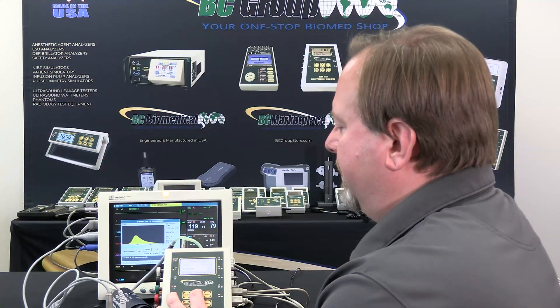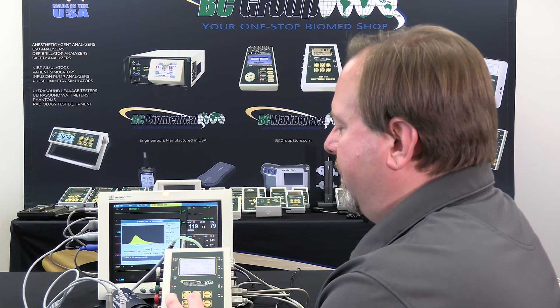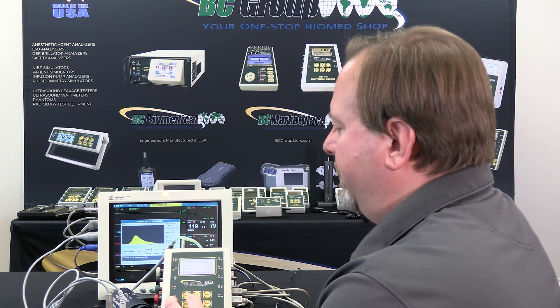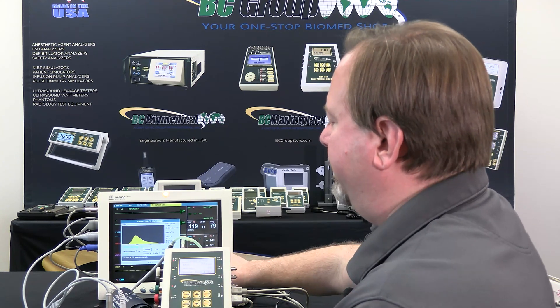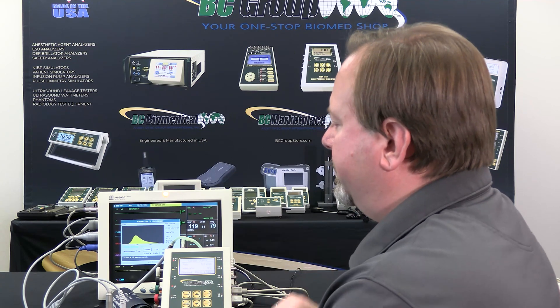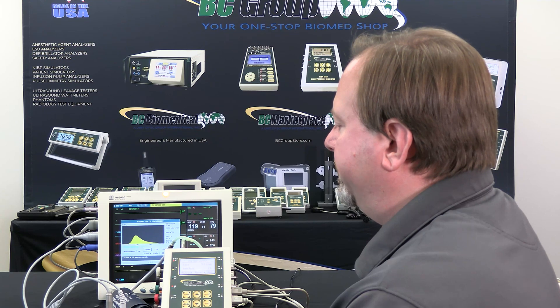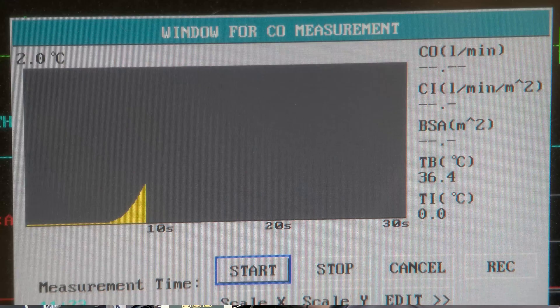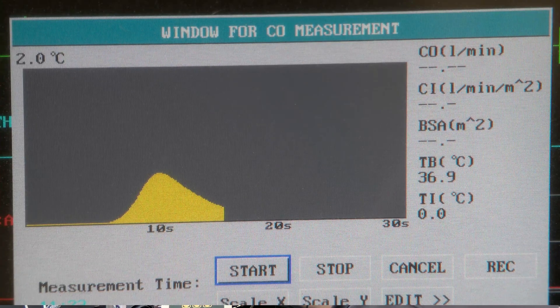We can change the flow rate and the injectate temperature on the NAVP-1040 using the select and the up-down arrows. In this case we're going to go for a 5.0 liter per minute injection. Again we start the monitor first so that it's ready and monitoring the input, and then we start the simulation. The monitor will read the simulated temperature and provide a measurement of the flow rate.